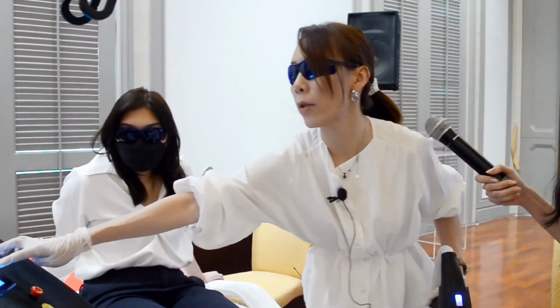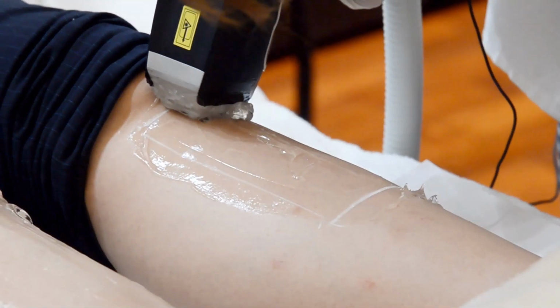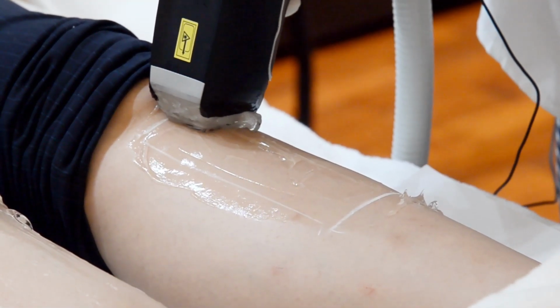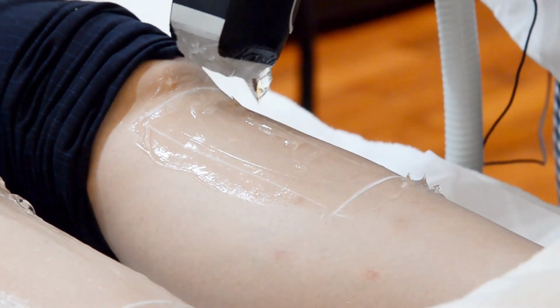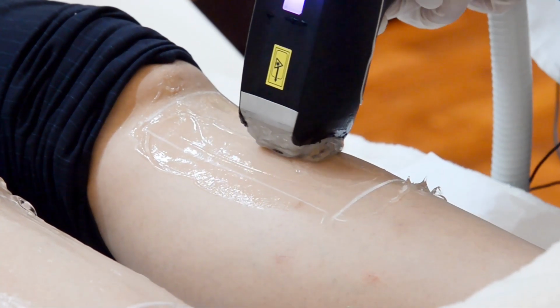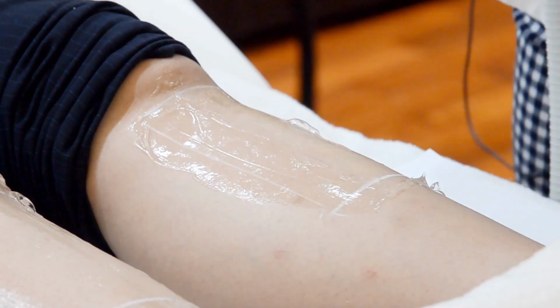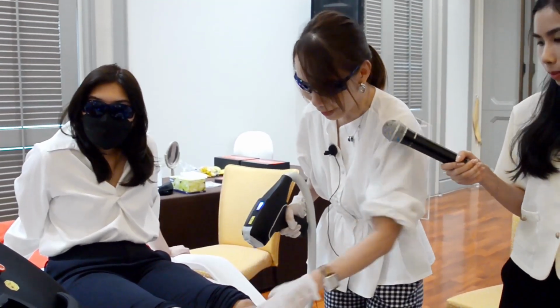So if I move on to the 3, this one you'll move a bit faster than the previous 2 hertz, because you're delivering 3 hertz in a second. So you've got to move a bit faster. Any questions? Just let me finish this area.